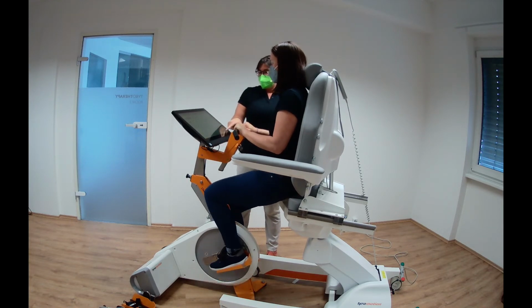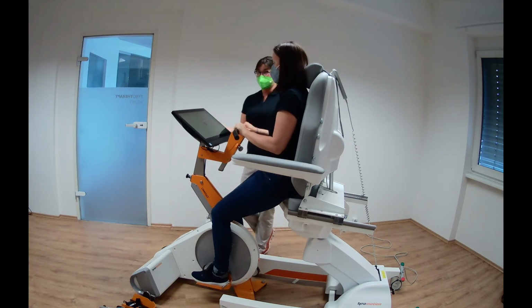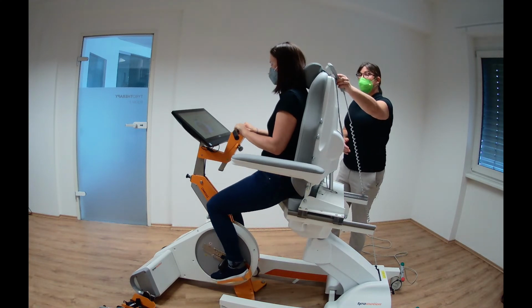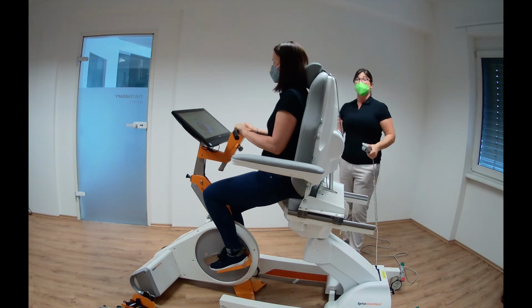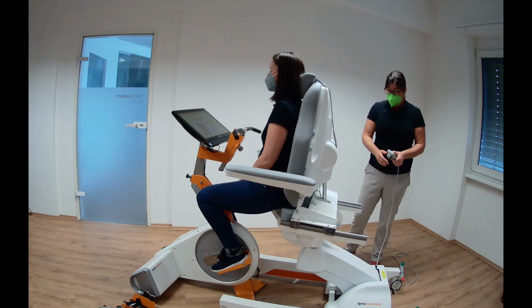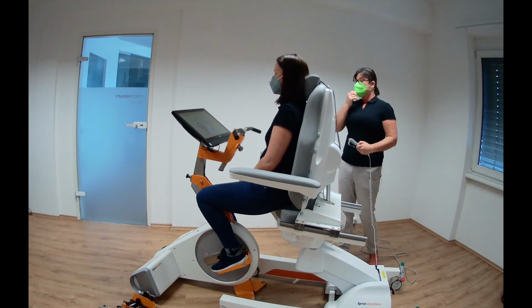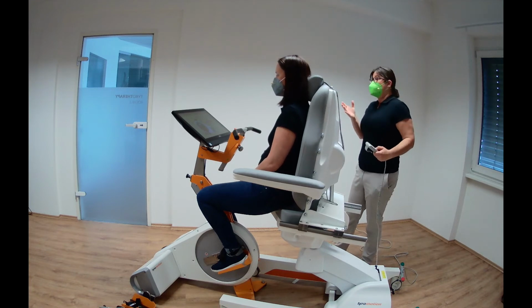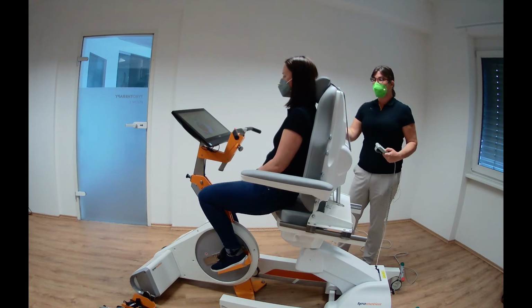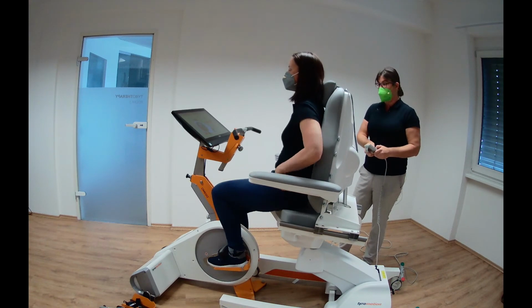All right, so if we stop here, the therapy sequence will now bring us to the next therapy we selected before. This is the leg press mode. So as you saw now, the stepper mode is a mode where we focus on repetition. We want to see a lot of repetition in almost a short time. So here in the leg press, we focus on an active movement and not especially on a high amount of repetition. I mean, you can do it, but it is more that we want her to actively strengthen her muscles. And for strengthening, you have to do an active movement.